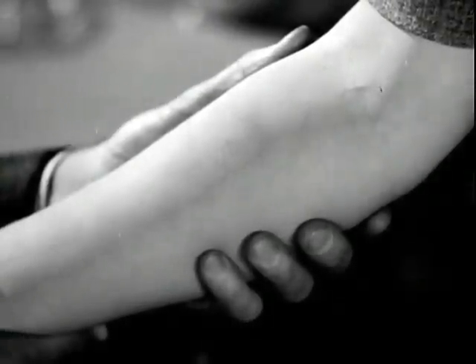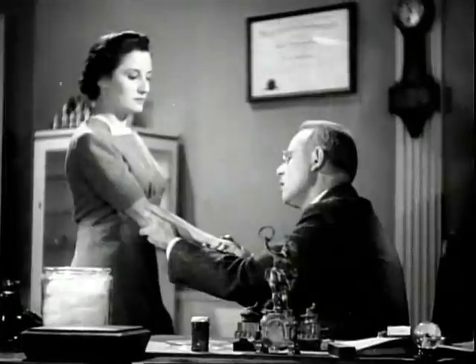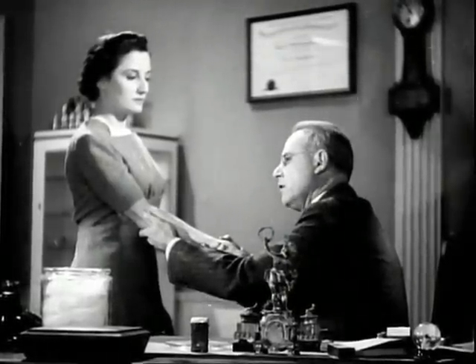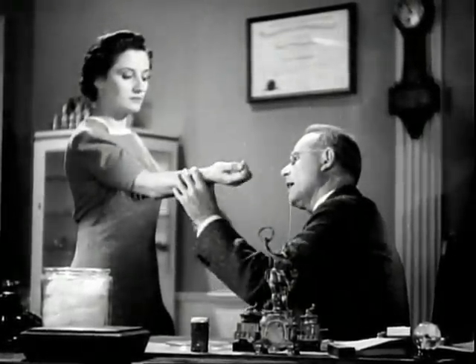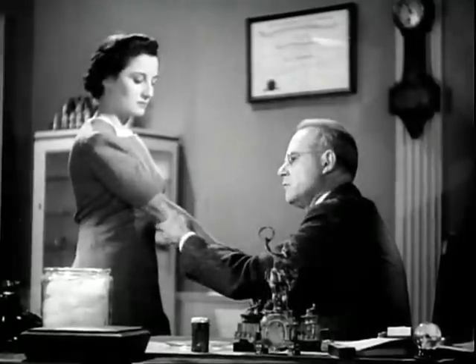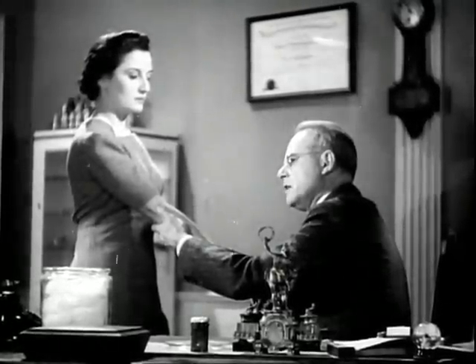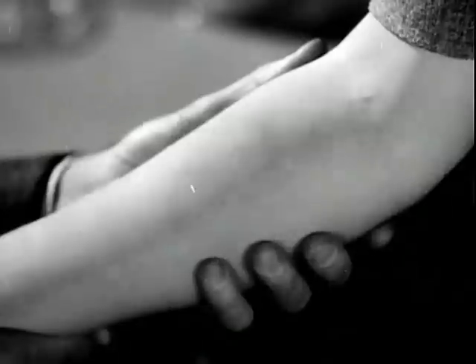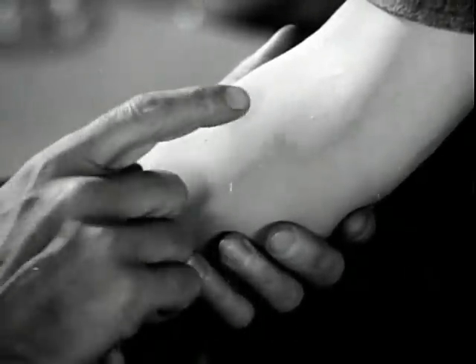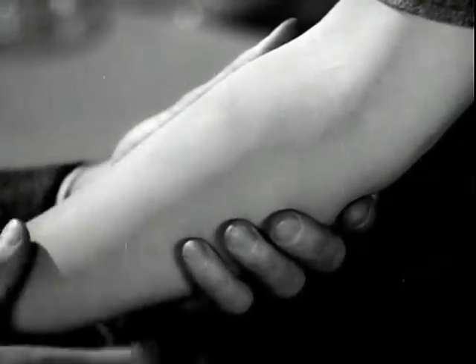The test is read in 48 hours. Hold the arm in a good light and flexed a little at the elbow — taut muscles may obliterate the reaction. Look across the arm rather than down on it. A positive reaction is one that shows edema and redness of varying degree. If there is no edema, the reaction should be considered negative. When in doubt, pass the finger over the tested area.